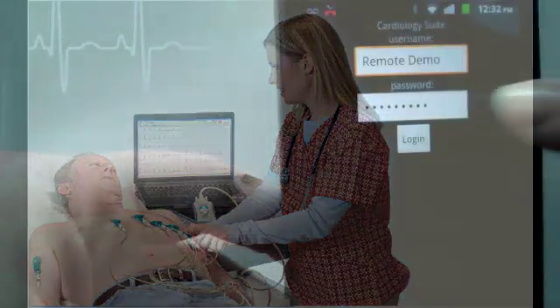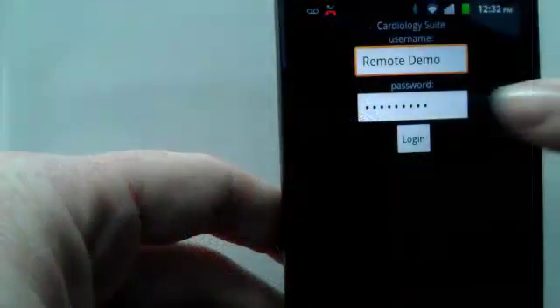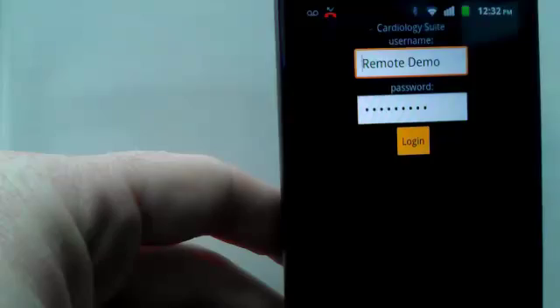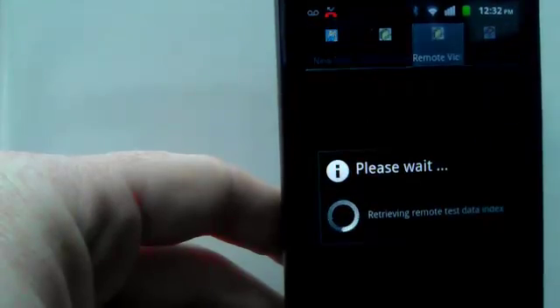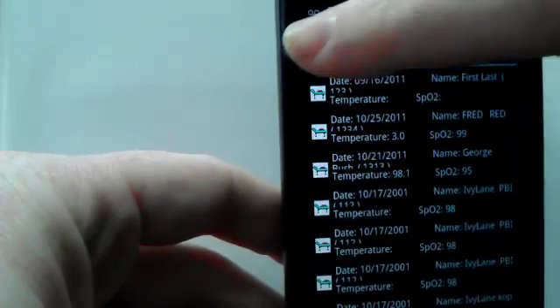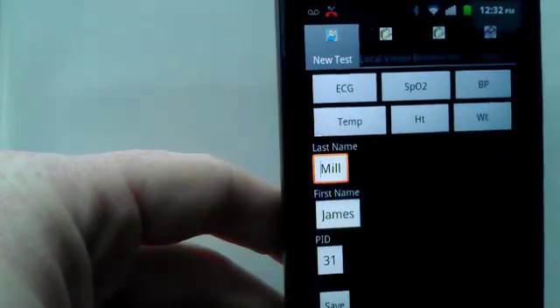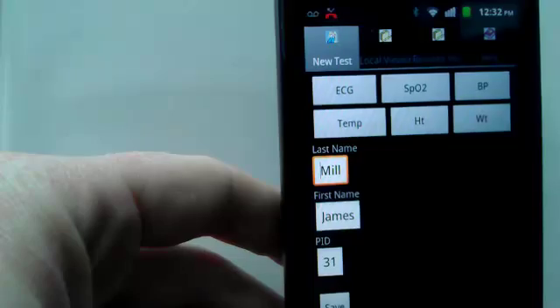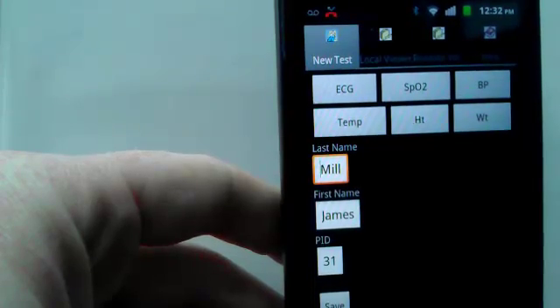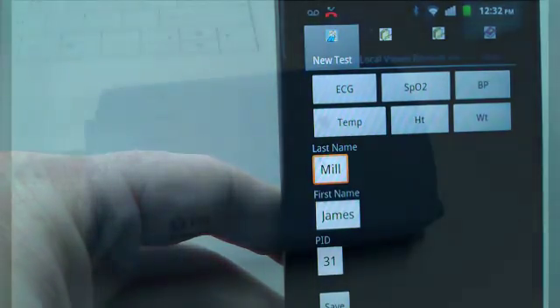To begin, log in to your Cardio Remote account on your phone, tablet, or laptop. For this demonstration, we'll use an Android phone. Click New Test to start collecting information for a new patient.